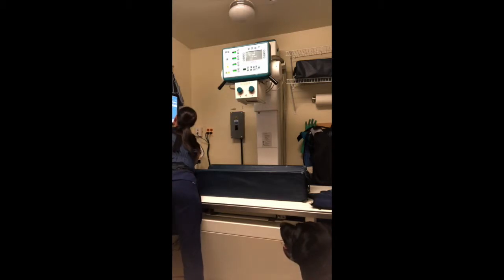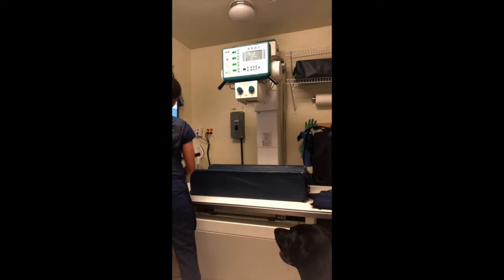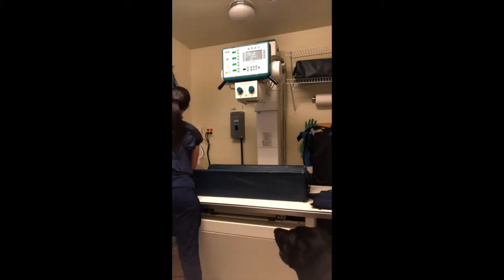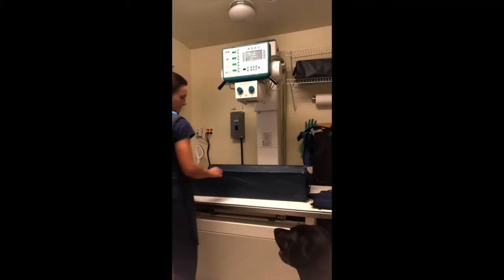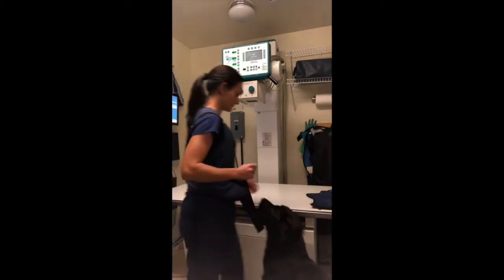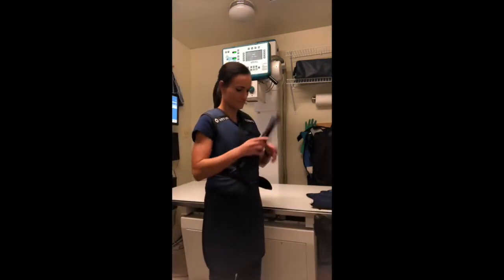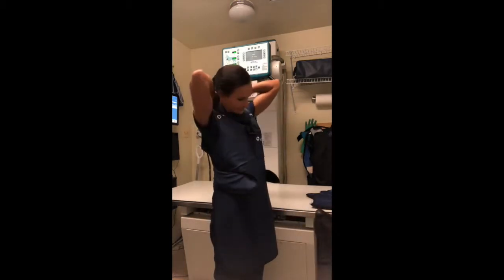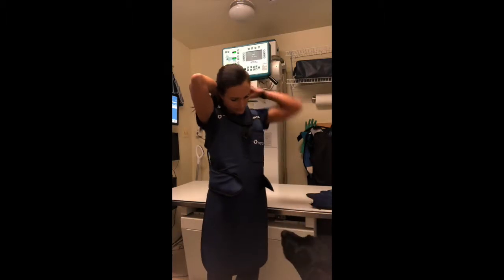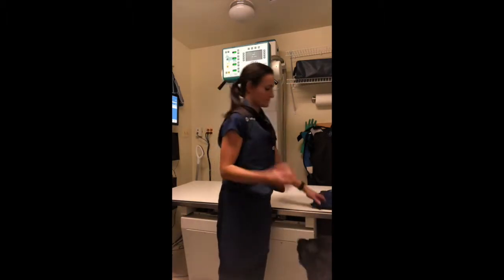Ideally, you want to have someone helping you take these radiographs because most patients won't be as good as my dog, and you will see how I struggle here anyway. So while you watch this miserable part of my video, I will list the pros and cons of each contrast agent. First, oral organic iodine ionic solution, used for suspected intestinal perforation and obstructions.